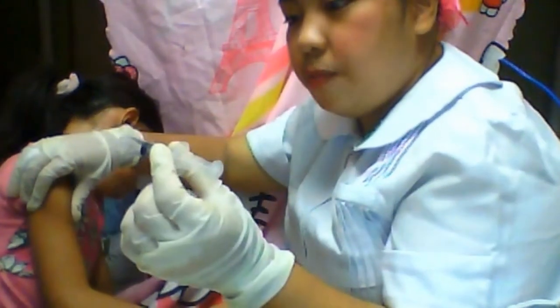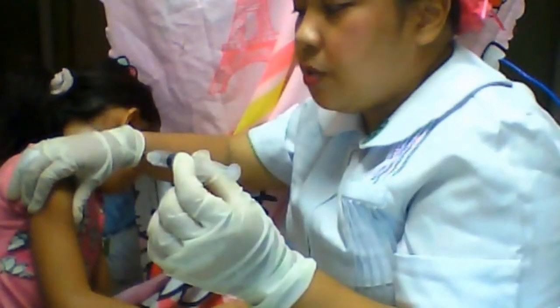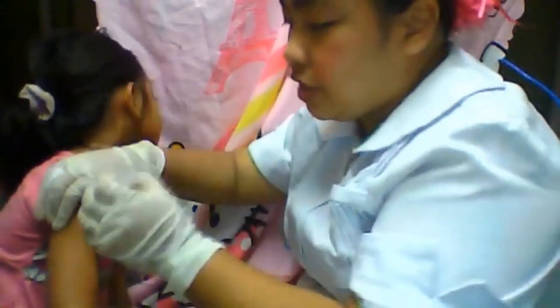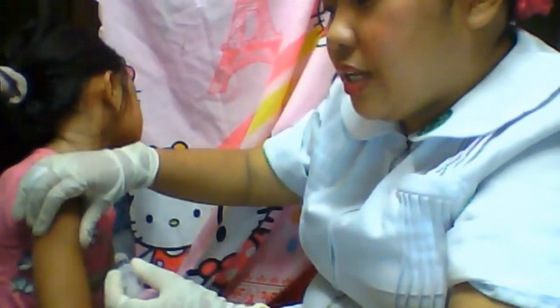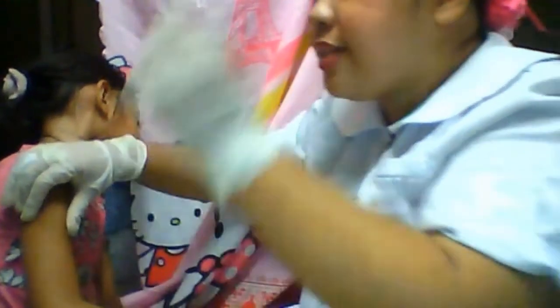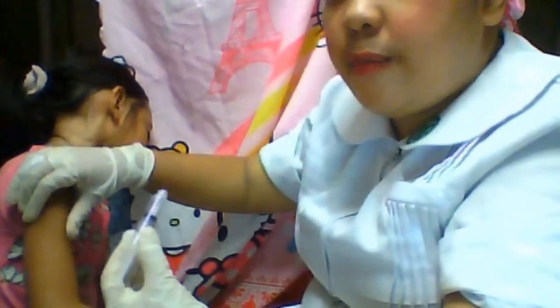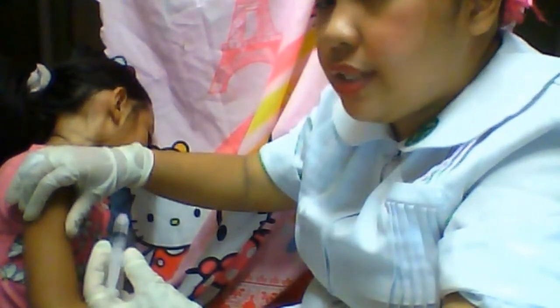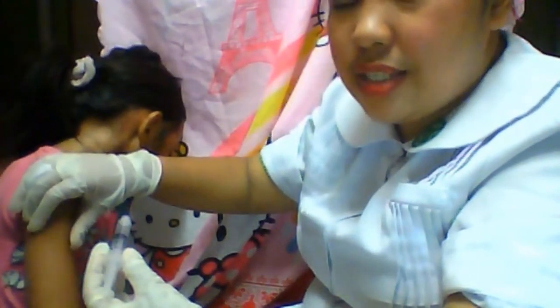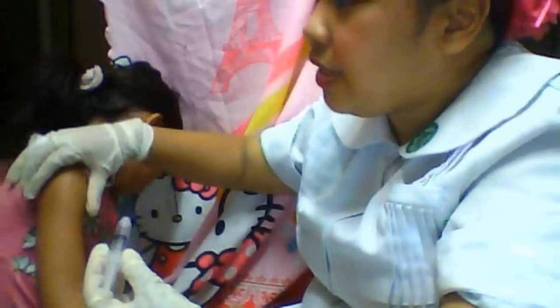Okay, and then you will have to inject fast. Okay, punch it fast, because that would actually cause less trauma and be less hurtful to the patient compared to injecting slowly. But once you have injected, you have to introduce the medication within 10 seconds. Not too fast, not too slow, because too fast an introduction of the medication would cause discomfort to the patient. So let's just do it moderately.